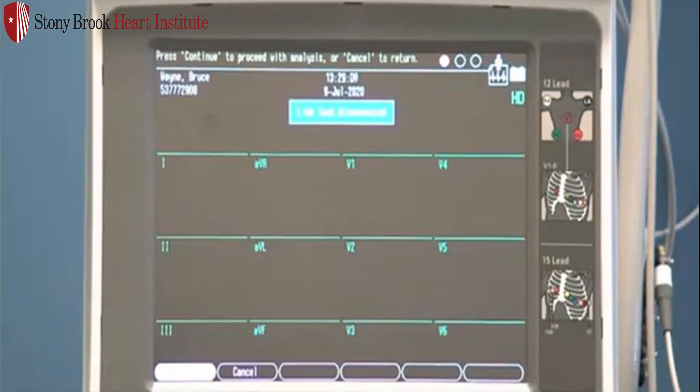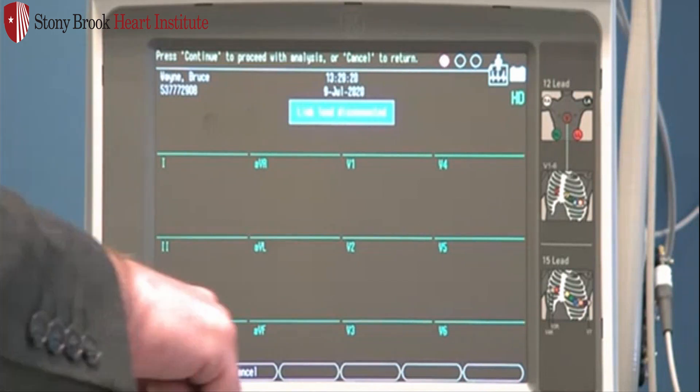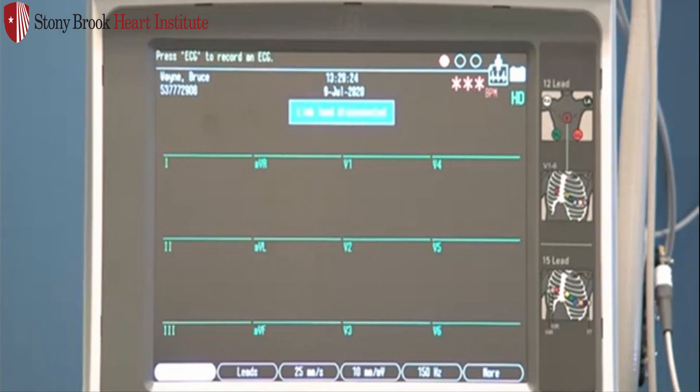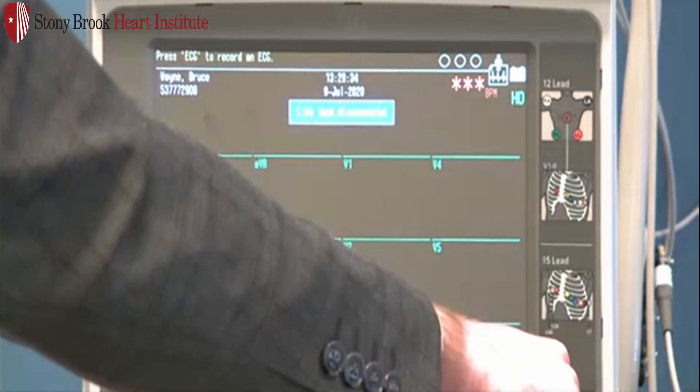This is what we call the preview screen. It's basically a snapshot of that ECG and is another quality checkpoint. If you're not satisfied with the quality from this screen, don't press Continue. Instead, press F2 to cancel. It will return you to the live screen. You can then change the electrodes, perhaps do a better prep job to get a better quality.